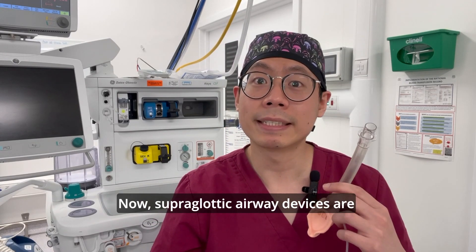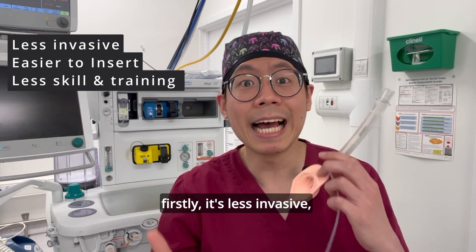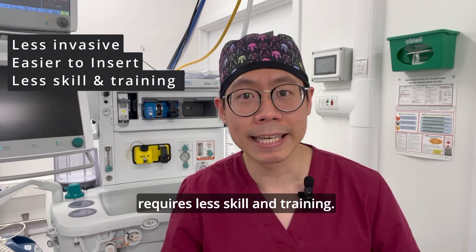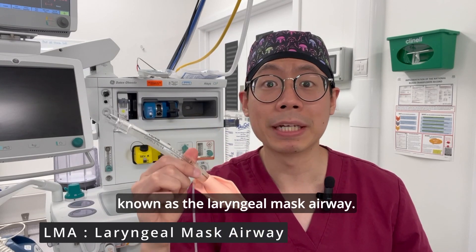Now supraglottic airway devices are sometimes preferred over a tube which goes into your windpipe because firstly it's less invasive, it's easier to insert, and requires less skill and training. Let's start off with the LMA, also known as the laryngeal mask airway.